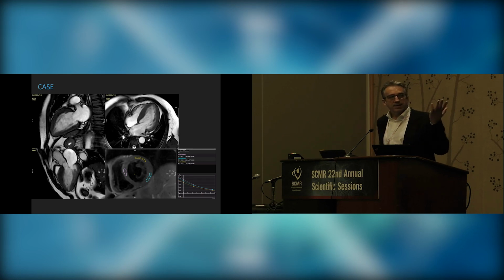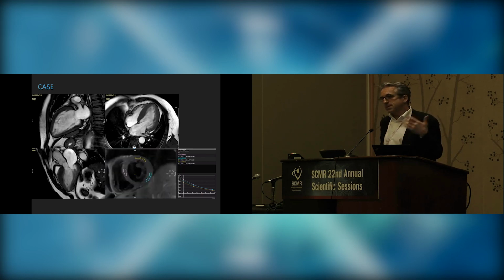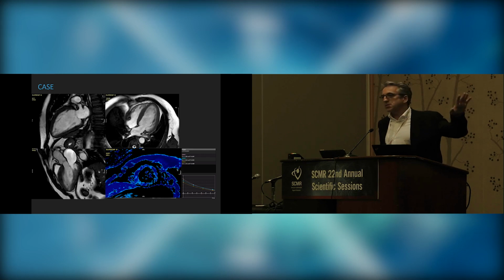So looking at the T2 map shows that some areas, in this case the infralateral wall, are different, and of course you can do this as a map and get these numbers straight as a quantitative measure and not so much just the signal intensity to look at. So in this case it took just 20 minutes and we had all we needed to know.